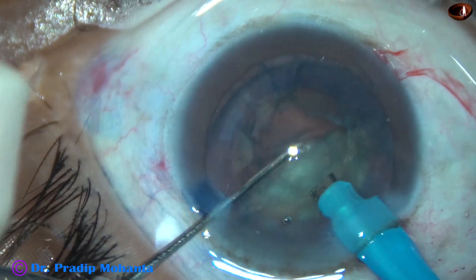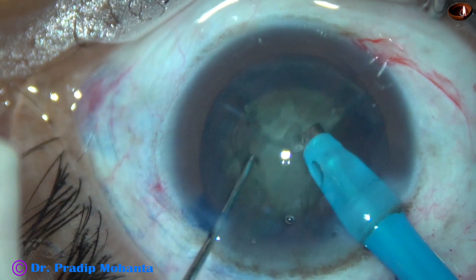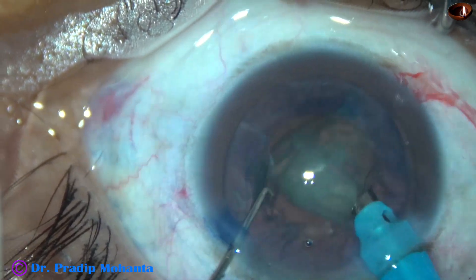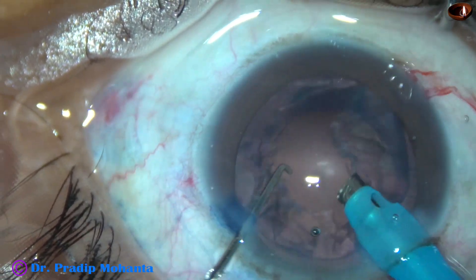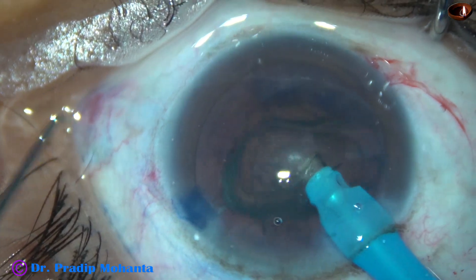Each nuclear fragment is emulsified and removed. Ultrasonic power used in this case is 60%. Flow rate is 45 ml per minute. Vacuum is 450 mm of mercury. Epinucleus is also removed.